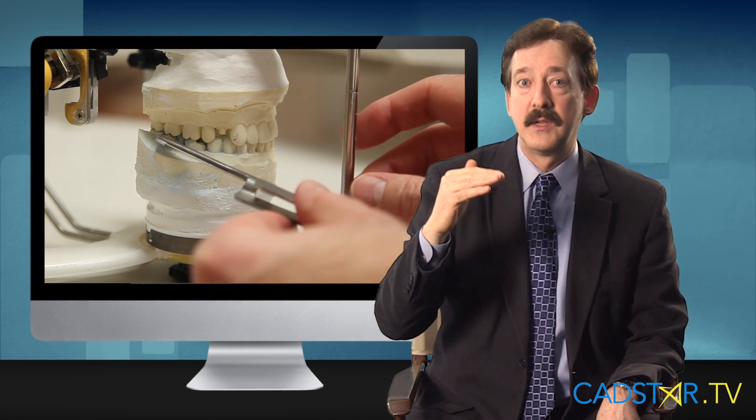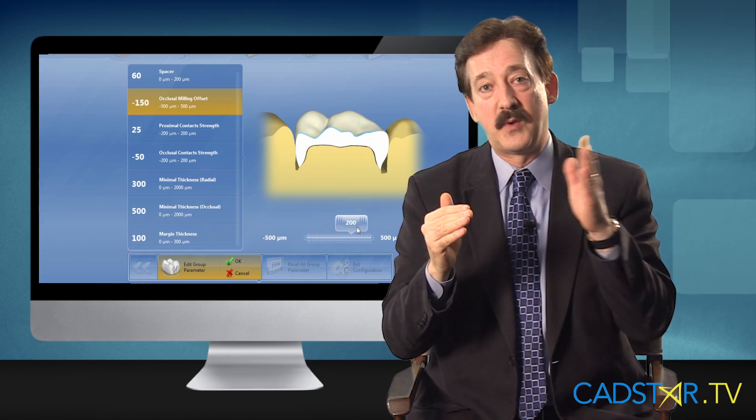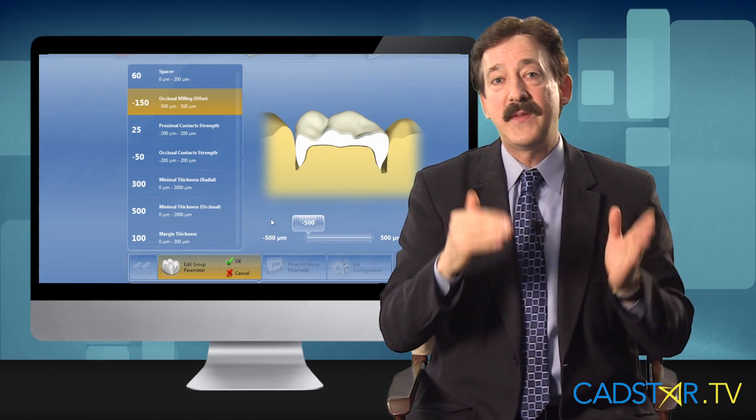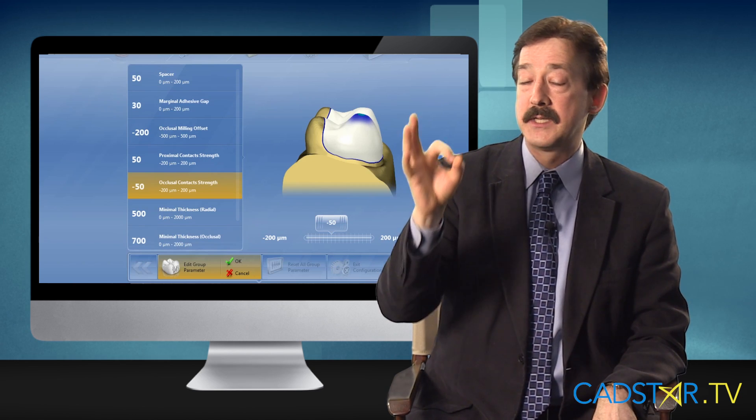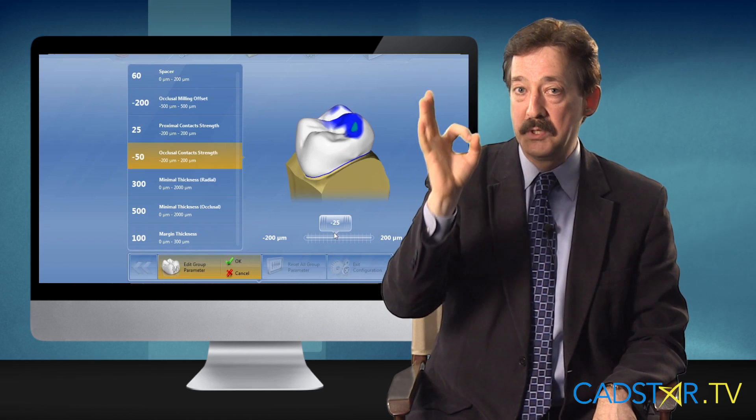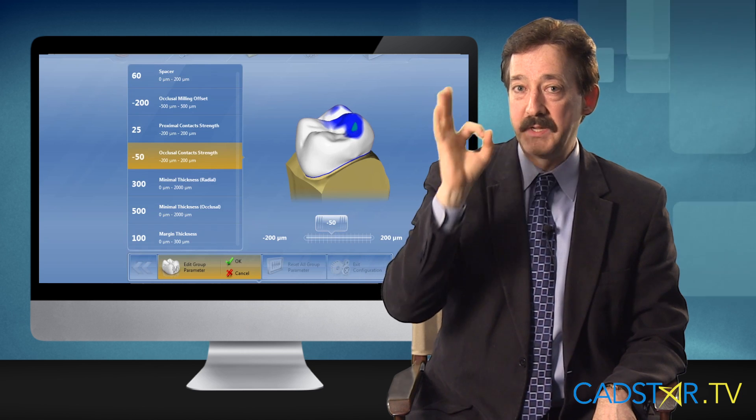It is true — you can take an opposing arch and a buccal scan even when you're doing biocopy today and get the benefits of the opposing arch if you want to refine the occlusion. That's the second factor that affects occlusion. In biogeneric, I use occlusal offset at negative 150 with negative 50 on occlusal contact strength, which means my occlusal contacts show as light blue. That's really consistent.